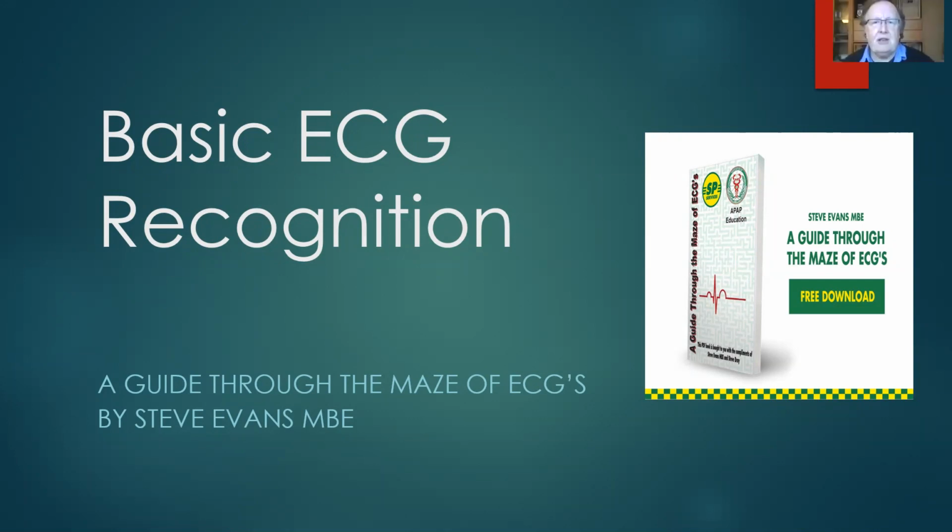Right, well, welcome to this webinar on basic ECGs. And when I say basic, I mean really basic. If you're of a certain age, you would know the Janet and John Book 1. It's when you're starting out on any particular subject. And so for me, we're going to go through this in a really simple way.